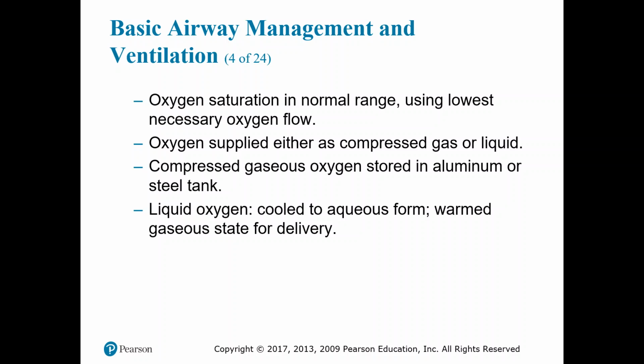The default pressure for therapy regulators is 50 psi, which is controlled within the regulator to allow for adjustable low flow oxygen delivery, which is your 2 to 25 liters per minute, depending on your regulator.